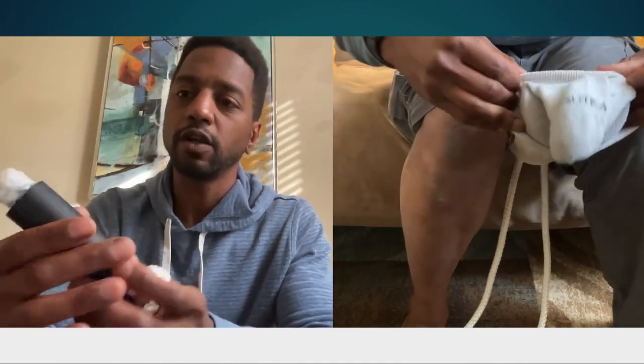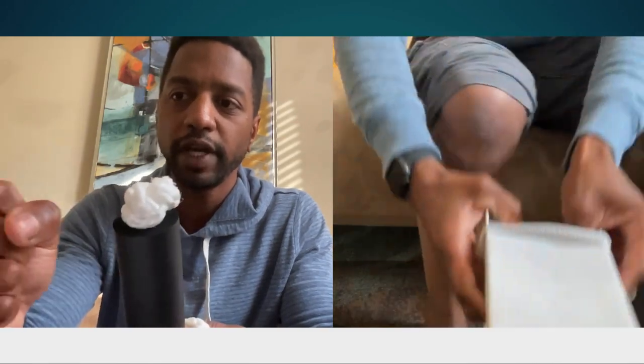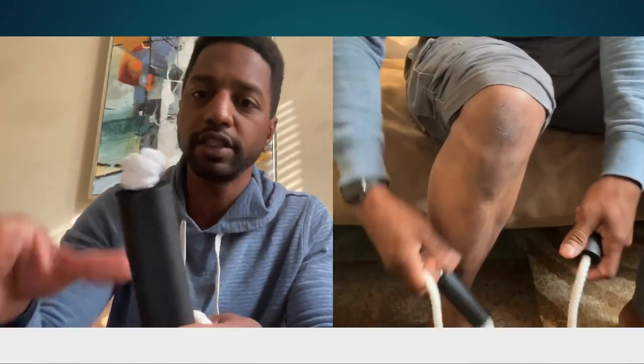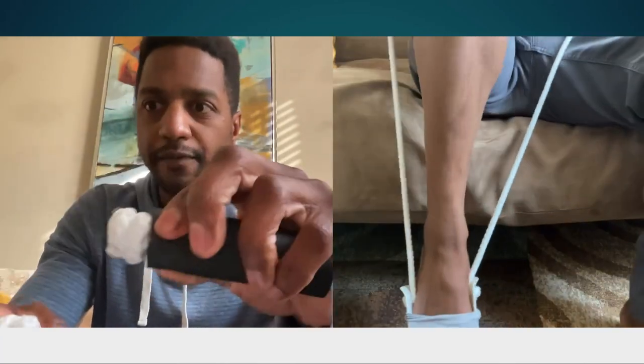The handles on this device are soft and larger to allow for someone with limited hand range of motion and limited hand strength to pull on with. They're very soft and they're very malleable.